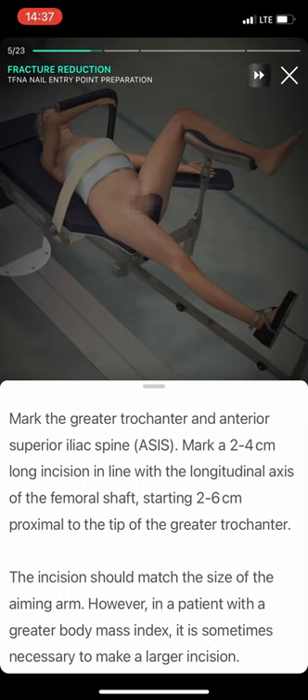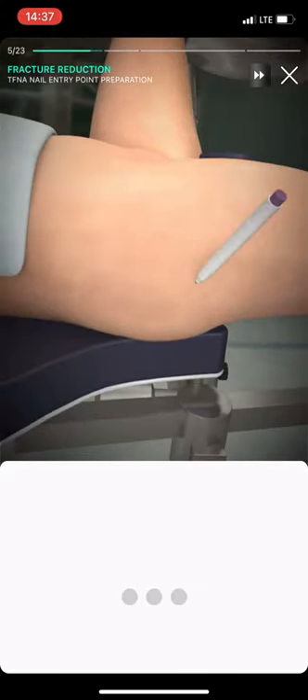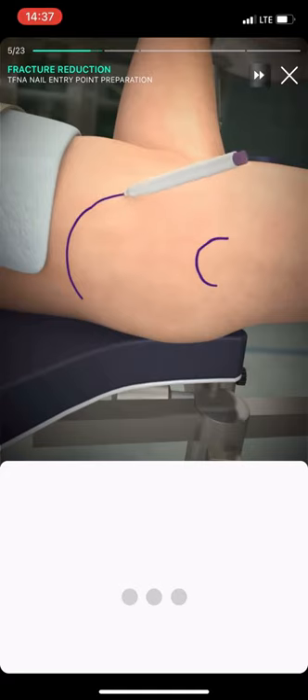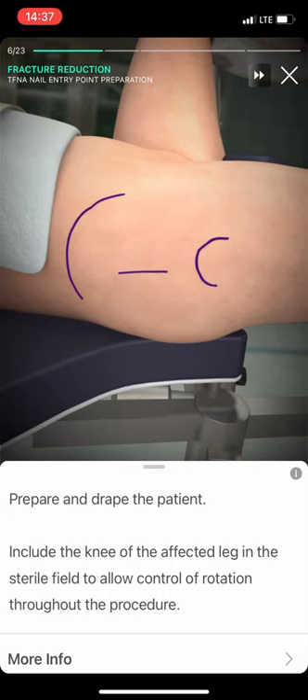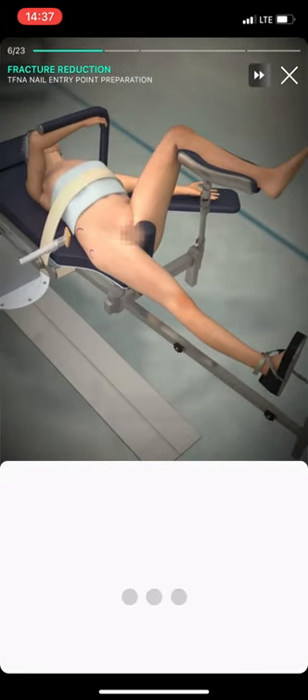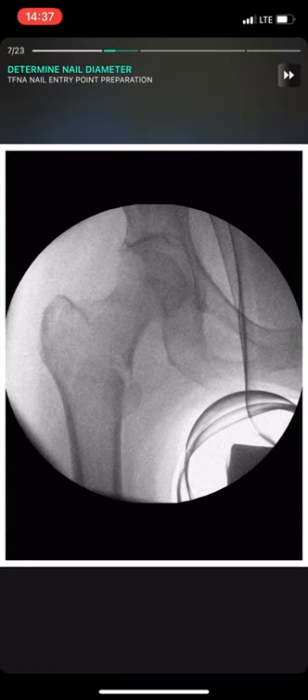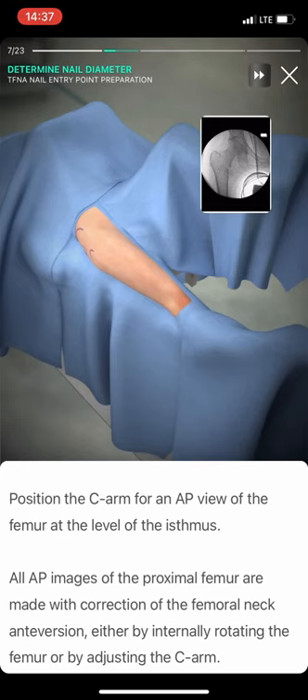Mark the greater trochanter and anterior superior iliac spine. Mark a 2-4 cm long incision in line with the longitudinal axis of the femoral shaft, starting 2-6 cm proximal to the tip of the greater trochanter. Prepare and drape the patient. Include the knee of the affected leg in the sterile field to allow control of rotation throughout the procedure.